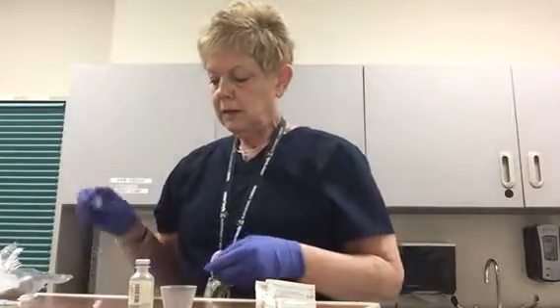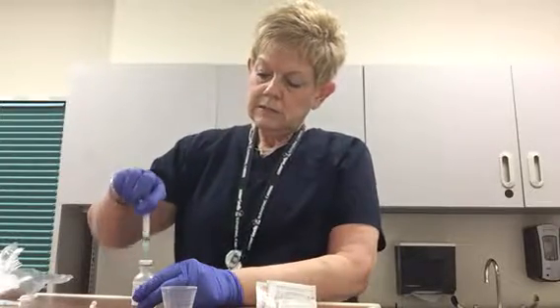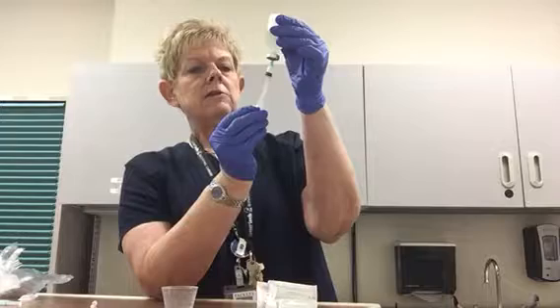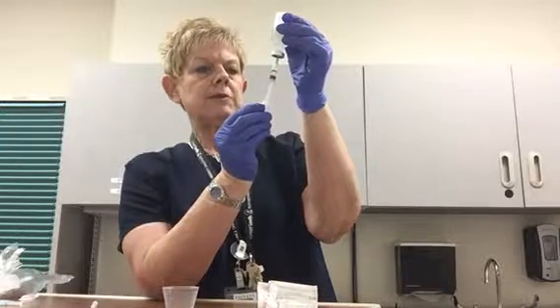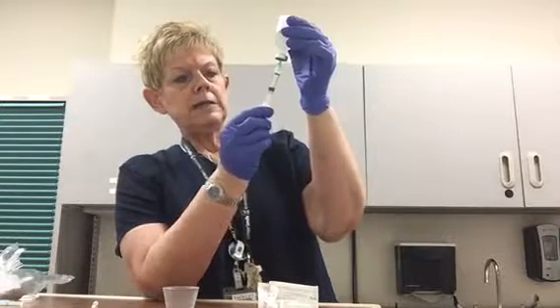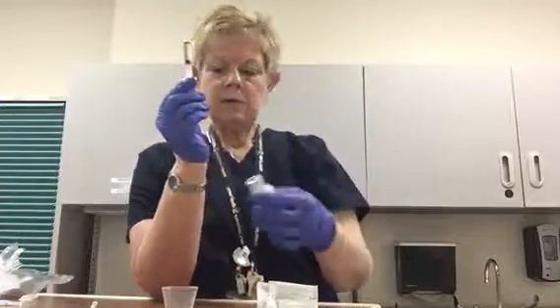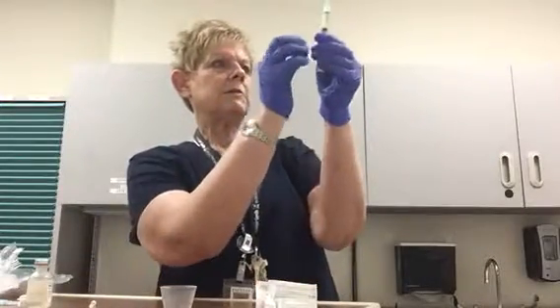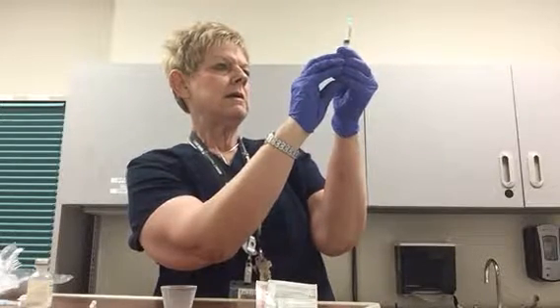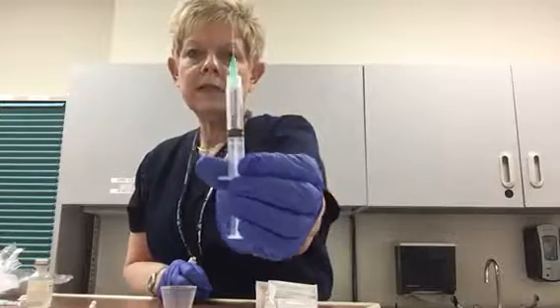Now I'm going to carefully remove the cap and push the needle down into the top of the rubber vial. Make sure the tip of your needle is inside the fluid in your medication bottle, and now we're just going to pull back very slowly until we have our two milliliters of medication plus a little bit more. Once I have that, I'm going to remove the stopper bottle, hold this up, and push the syringe up until I am reading two milliliters of medication.